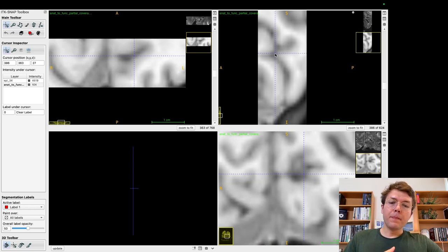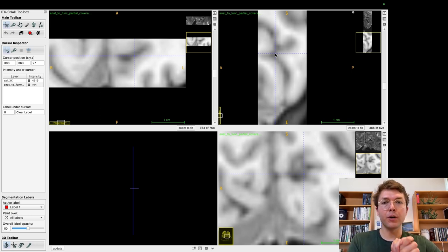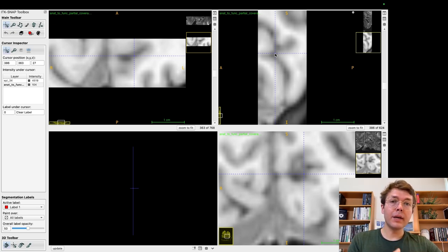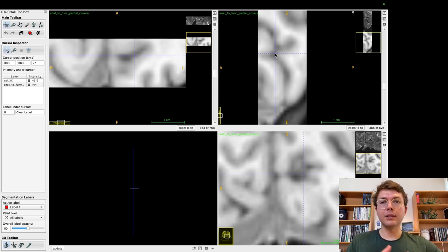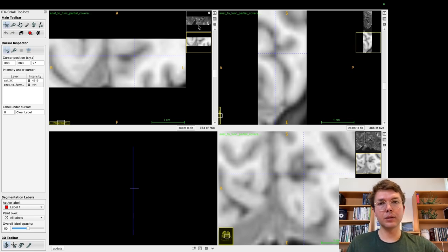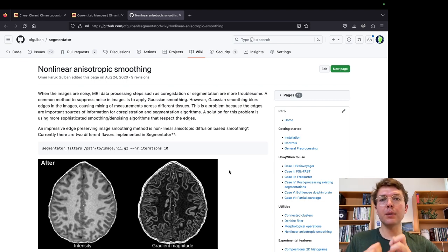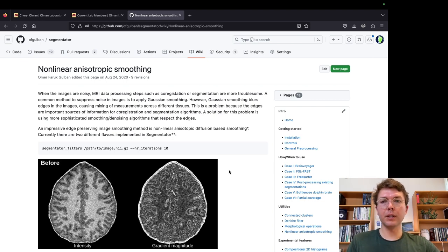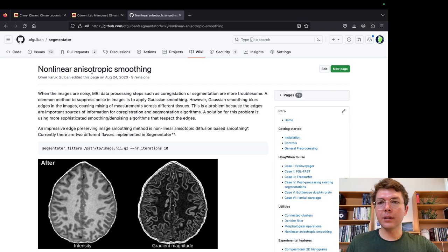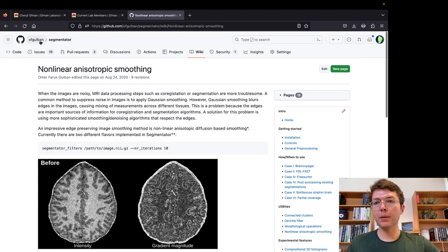So problem number one: for getting layers and doing layer analysis in this type of data, we first need to draw various gray matter boundaries. Our input data is required at a lower resolution — it's not truly 0.2 millimeter isotropic but we have upsampled both the EPI and T1-weighted data to this resolution. So first we want to increase the sharpness of our upsampled anatomical image so that we see the gray matter more nicely. To do that I'm going to use a nonlinear anisotropic smoothing method that I implemented a few years ago in one of my repositories called Segmentator.